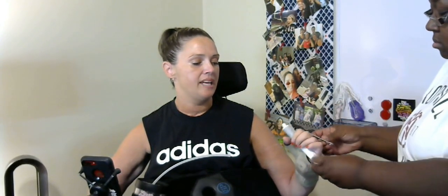I am here today and want to tell you about some of the things that I have purchased, as well as some of the things that I have created over time to help me eat better and eat more independently. The first one I'm going to tell you about is called Liftware, and it is a spoon, or you can get a fork attachment for it, and it has a motor on it, and it helps you keep whatever is on the fork or the spoon straight.